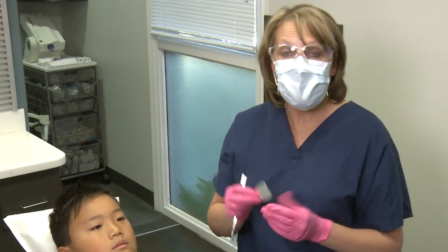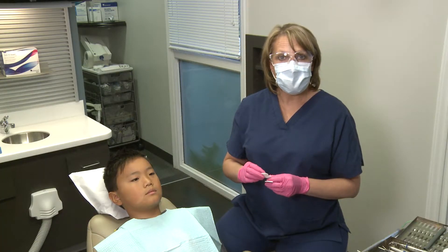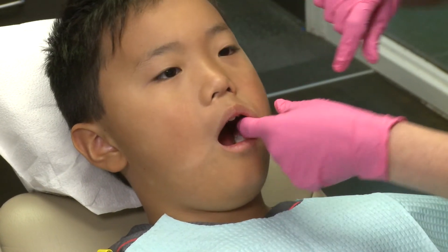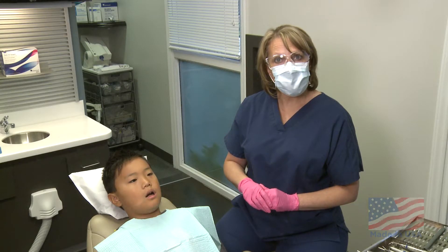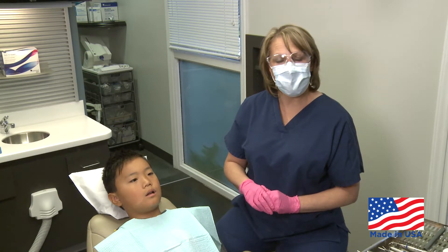Hygienists love them because they're not used to having to keep a dry feel. Richmond's Reflective Shield Plus is placed on the buckle. It can be used alone or in addition to a braided roll that can be placed on the lingual side. Richmond's Reflective Shield Plus are proudly made in the USA and are available through your favorite dental dealer.